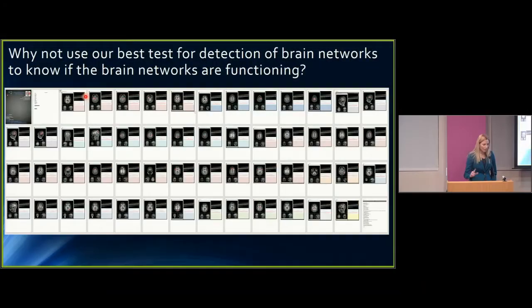And you're not supposed to be able to tell anything by looking at this, except that this is a bird's eye view of a typical clinical functional MRI report that is delivered to the ordering physician and is stored in the child's medical record. And each one of those pages is a different brain network which is commented on as being normal or abnormal or missing.